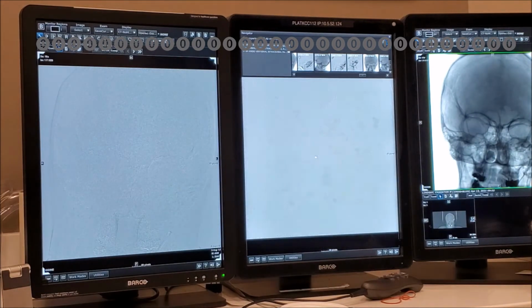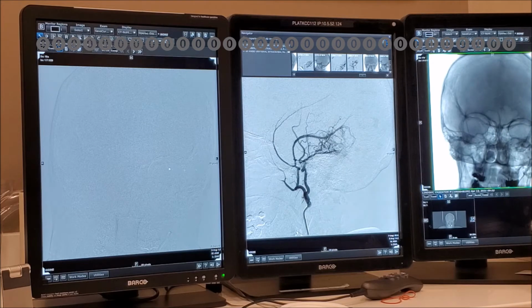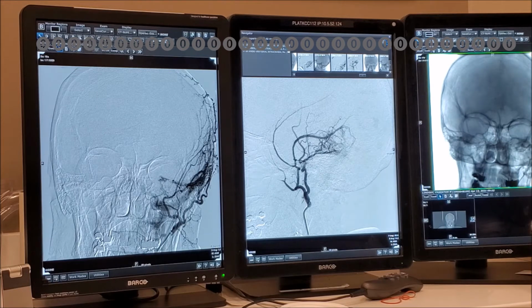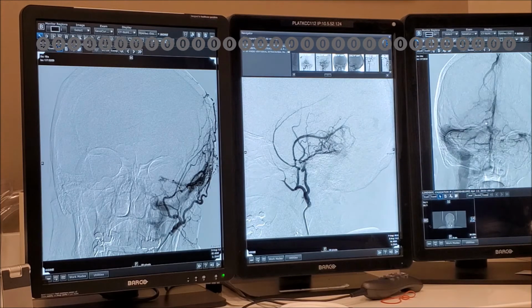Okay, and here you have a distal, external, very nice. Okay, look at that. We don't have this segment. We needed the brain. Let's see if the vert drains that part of the sinus. There should be a left vert run right at the end. There's a left one? Yeah. Okay, so we don't see this part of the transverse sinus. We don't see it, we see from sigmoid. Let's see, we see it at the last injection.